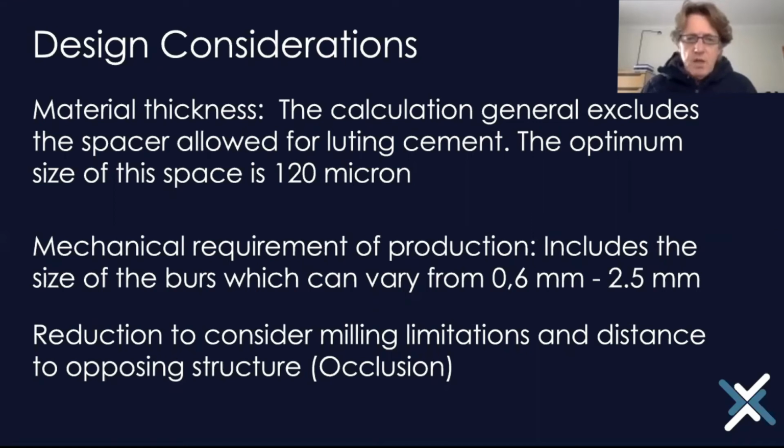And the spacer is there for your luting cement. So if you make that too small, then the fit is going to be too tight, and then you won't be able to seat your crown properly. And you'll see as we go along now, when we start looking at the prepping techniques exactly, then you will understand why we say this.